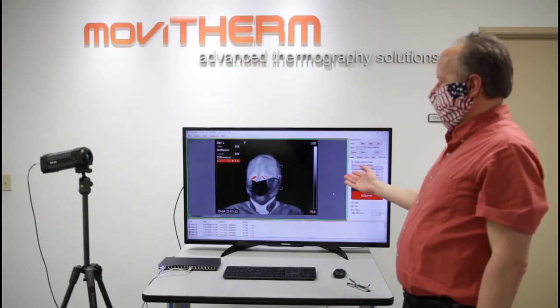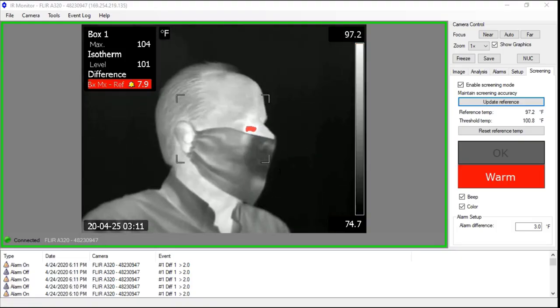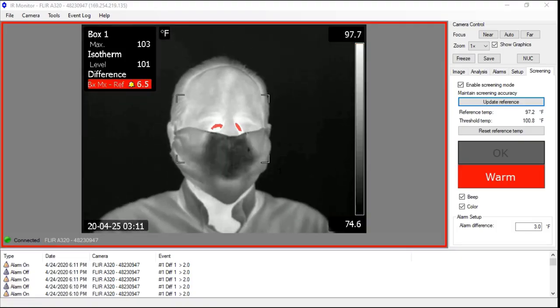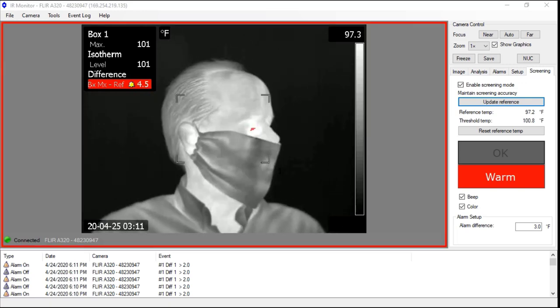So now we have an alarm that you can clearly see. I have heated up my tear duct, and the camera clearly detects this rather rapidly.